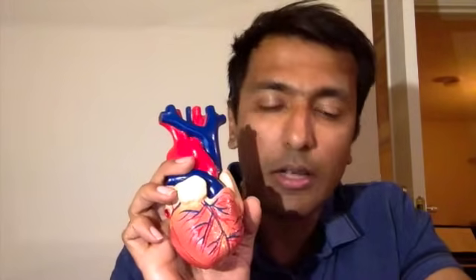The second thing that the echo report will mention is something called regional wall motion abnormality. Now, remember, the heart is a muscle, and this muscle is supplied by blood vessels, which you cannot see on the scan. But if one of these blood vessels is damaged or has been blocked as a result of a heart attack in the past or something like that, then that part of the heart muscle that's supplying will die, and that part of the heart muscle will not move on the scan, and therefore a specific region of the heart will not move, and this is called a regional wall motion abnormality, and points to a previous heart attack, or possibly sometimes even an infection of the heart muscle, which has caused an area of the heart not to move. And that's important, because that indicates a scar in that heart muscle, and that's something that needs to be investigated.